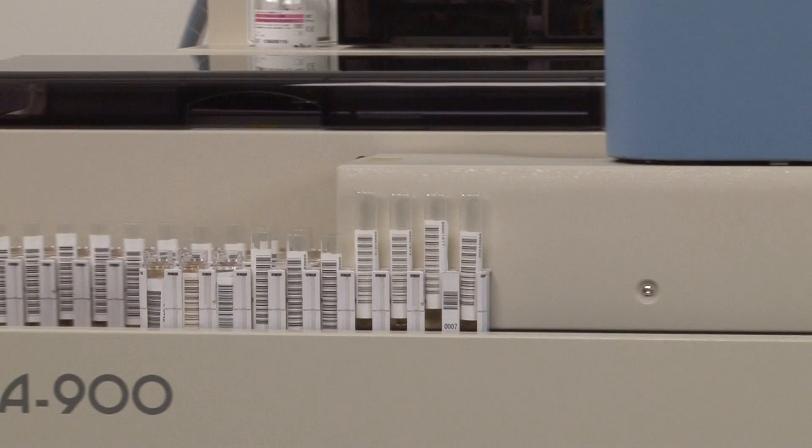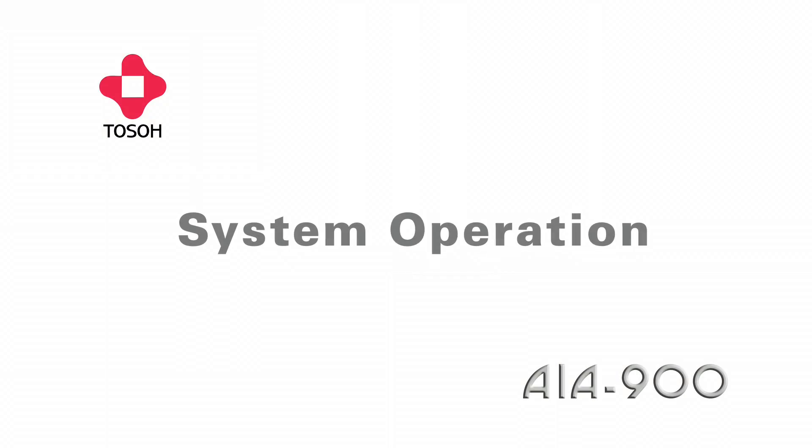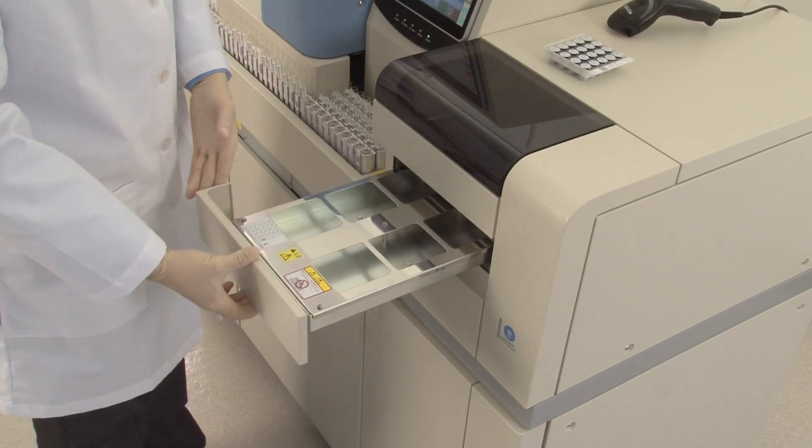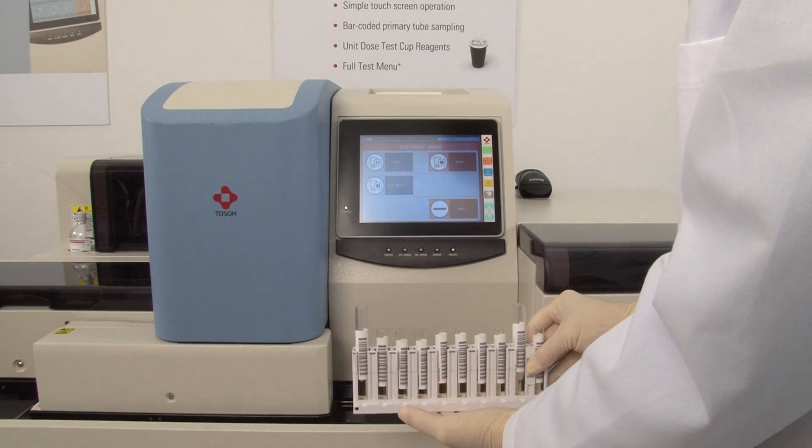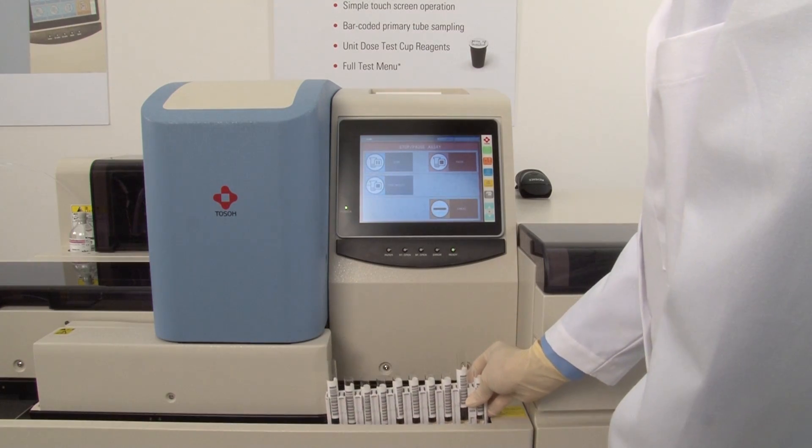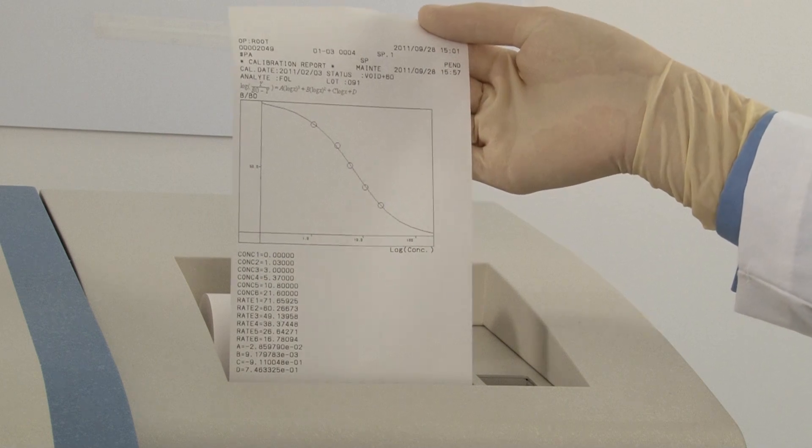Let's take a closer look. System operation. The AIA 900 operation is very simple and intuitive. The system is easy to set up and operate and requires no special electrical or plumbing needs.